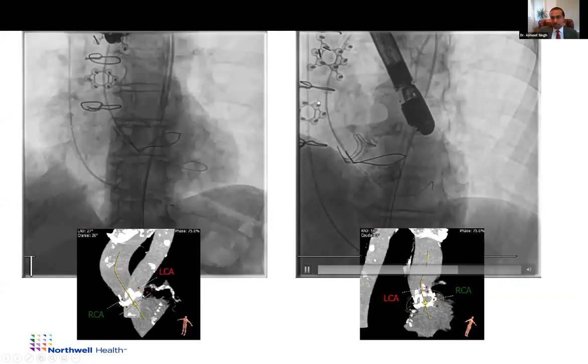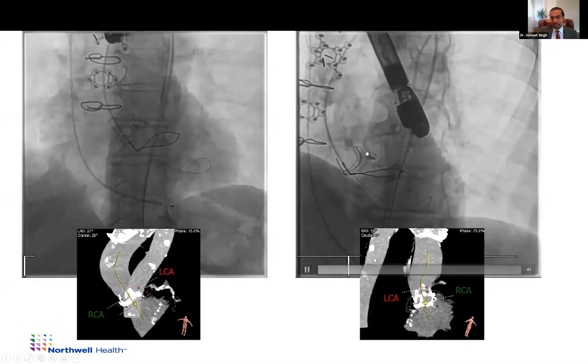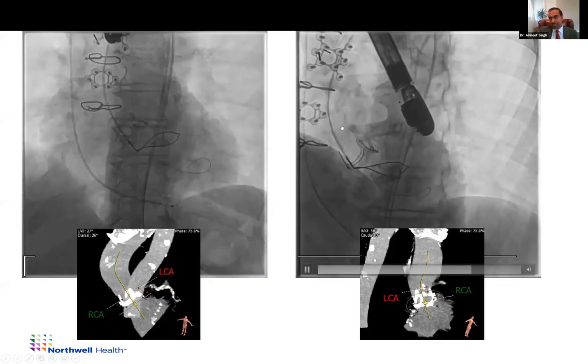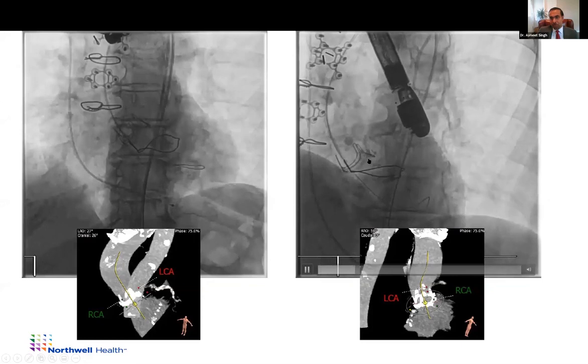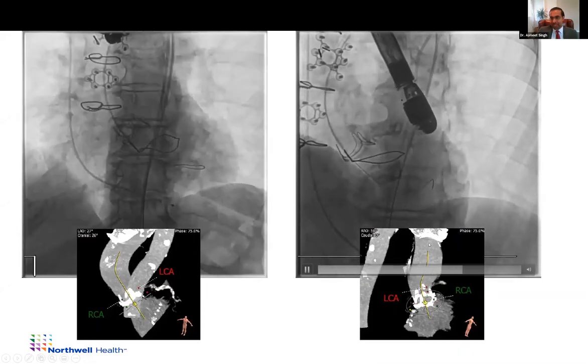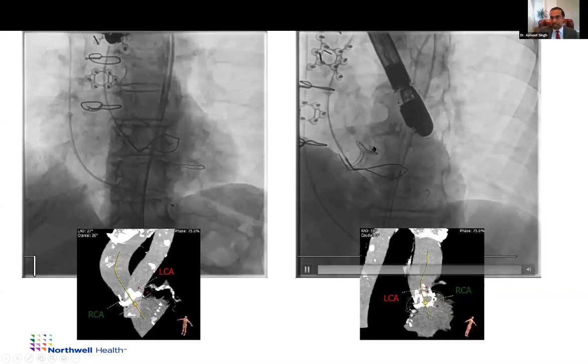The second step was to bring in a catheter, and these are dedicated catheters that are being designed for BASILICA, which is essentially an AL configuration with the catheter tip pointing down, and pointed the catheter at the base of the leaflet and use the TEE and our prior CT imaging to make sure that this was an appropriate site for the engagement.